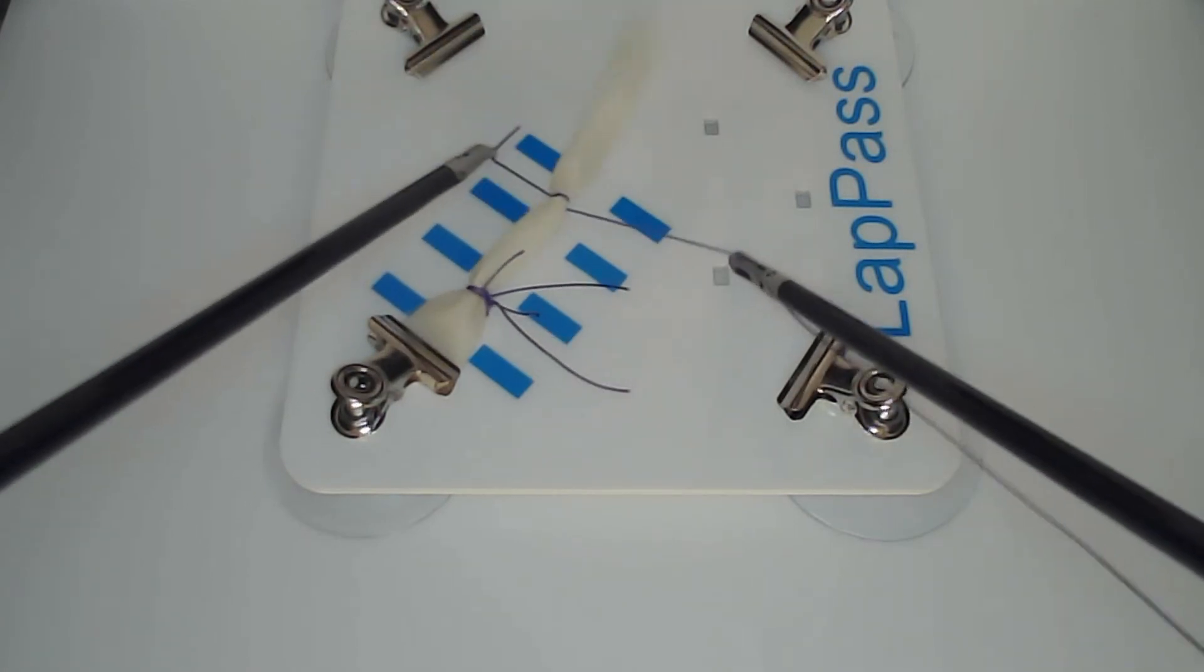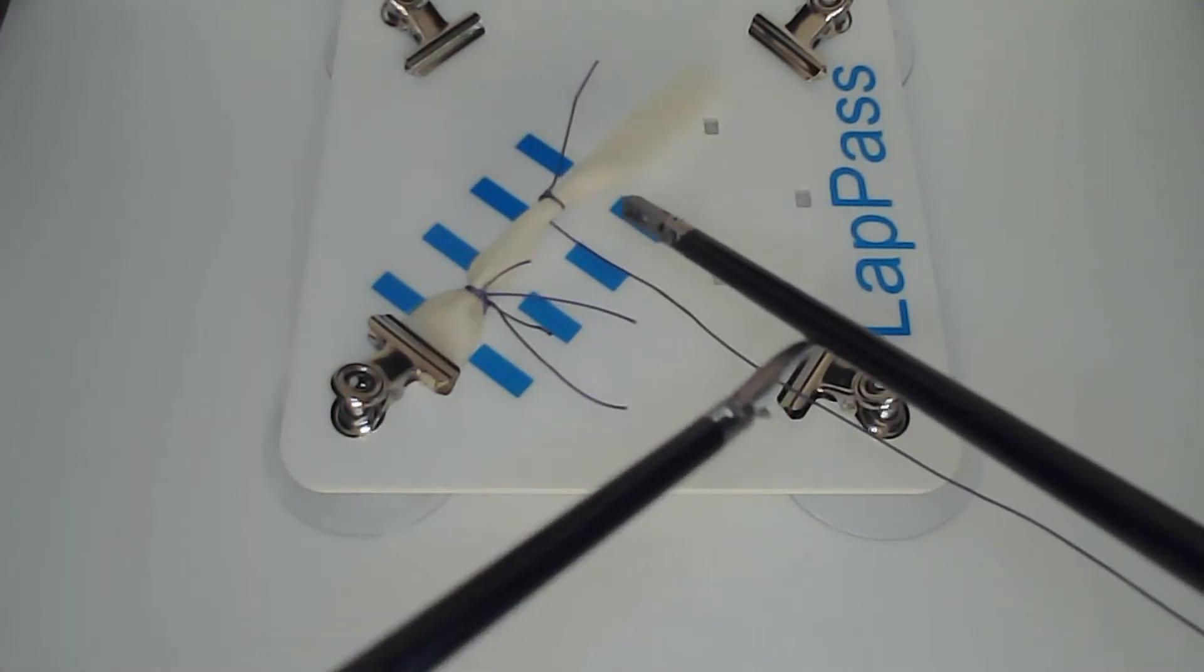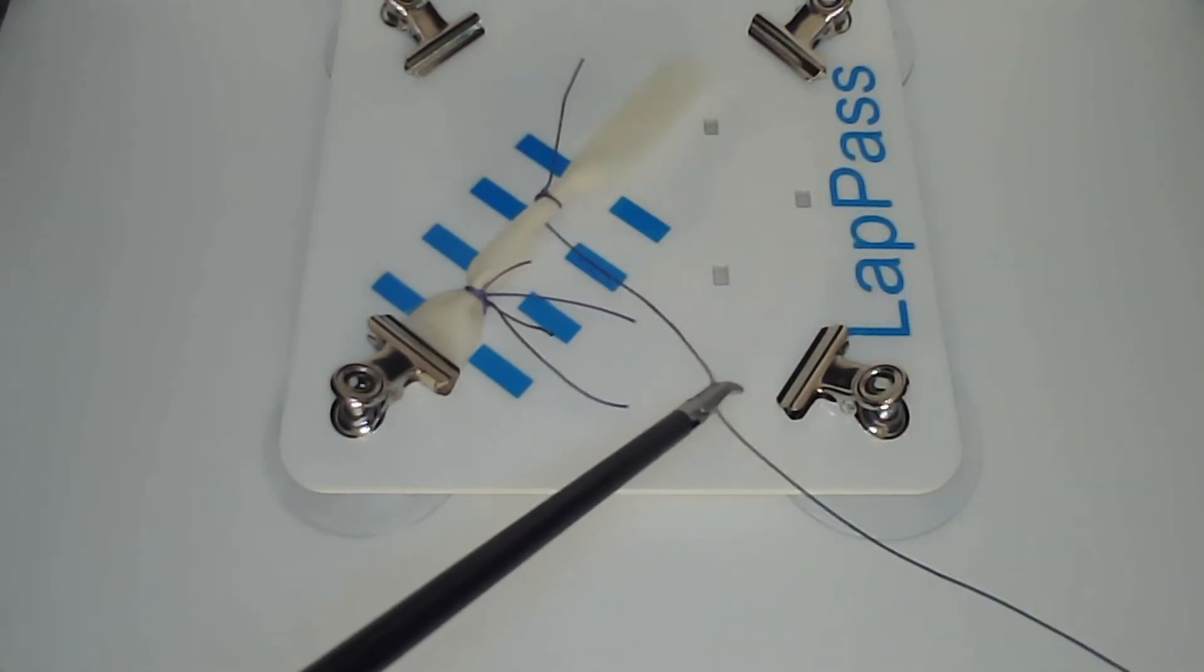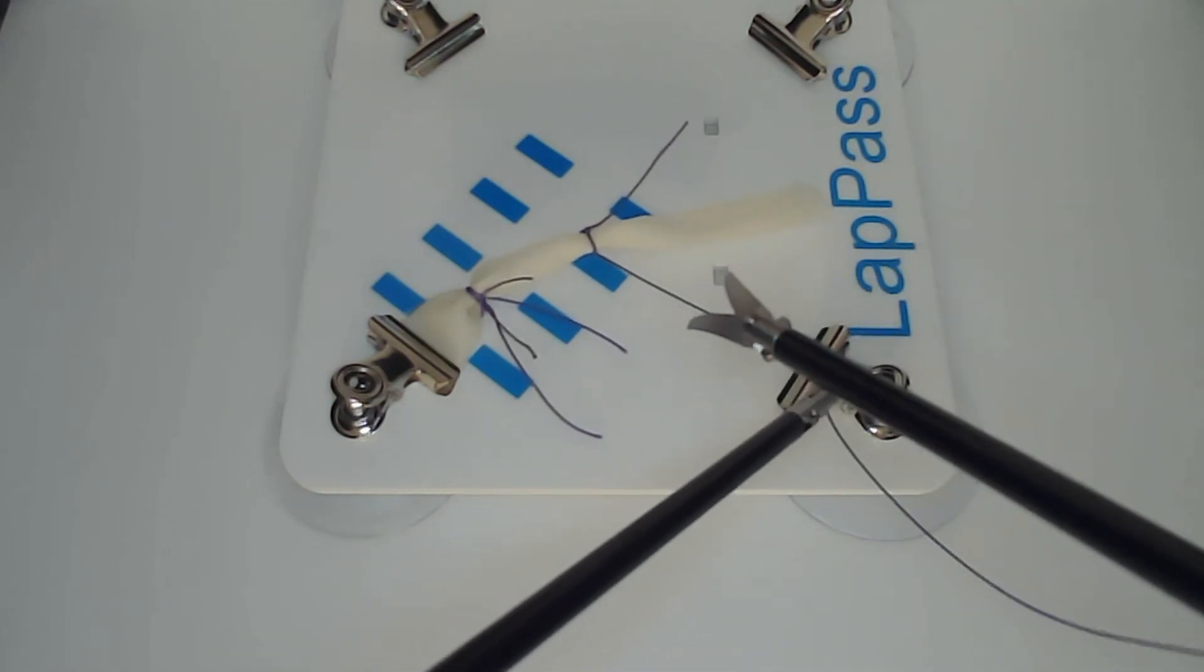At the end of the task, the security of these knots will be tested to ensure that they'll be secure and in an appendicectomy that they wouldn't leak.